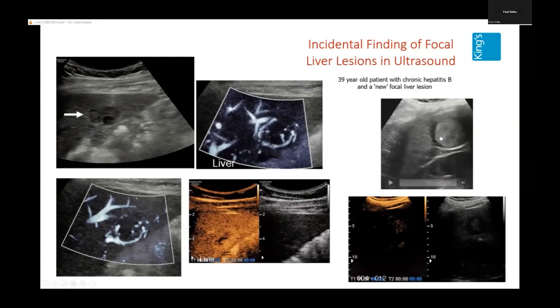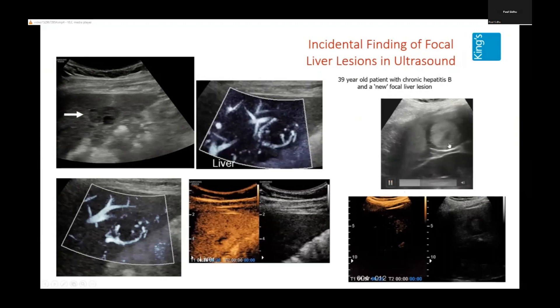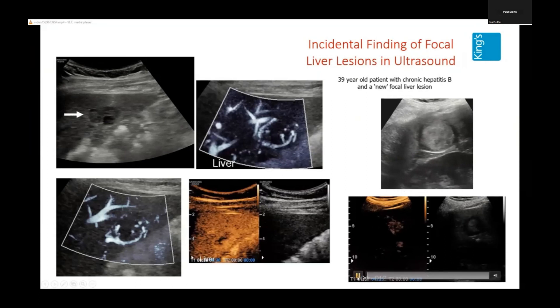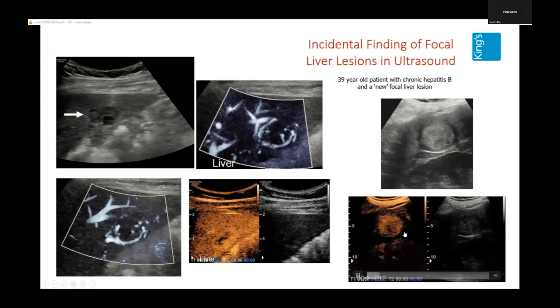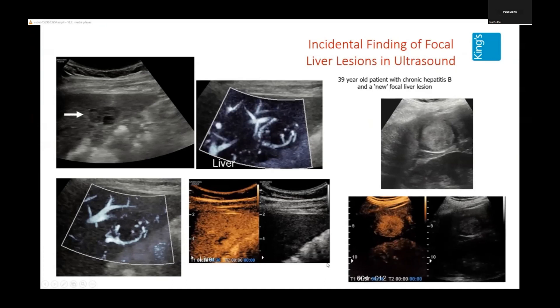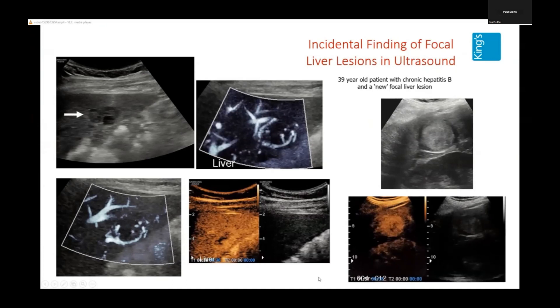This next patient in the liver clinic, with a lesion in almost the same spot, turns out to be quite different — on contrast-enhanced ultrasound it is hypervascular. Arterial phase hypervascularity normally means this patient has probably got an HCC — a hepatocellular carcinoma.